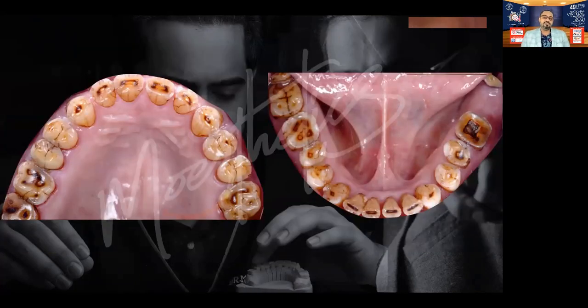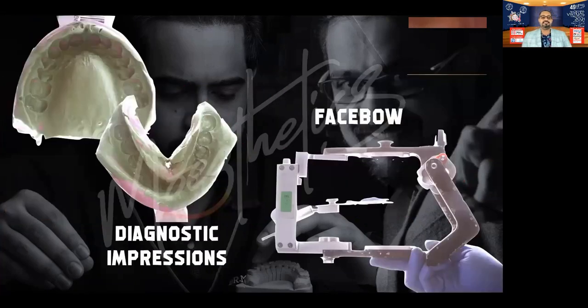This is how it looks from the occlusal surface — a lot of tooth material loss. So we went ahead and I restored this case in the same protocol. Started with diagnostic impressions and a face bow record.